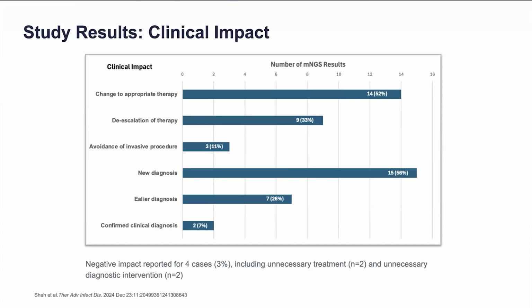So there are times you detect an organism on CMT, but you're not really sure it is the cause of the syndrome of concern. So you may have a positive sputum culture, patient coming with lung infection, and you're not sure if what you found, few colonies of X, Y, and Z organism in the sputum, is necessarily the cause of infection, but having a positive Karius with high MPM now pushes that suspected organism into the definitive category of a real infection, helpful in making clinical interventions.